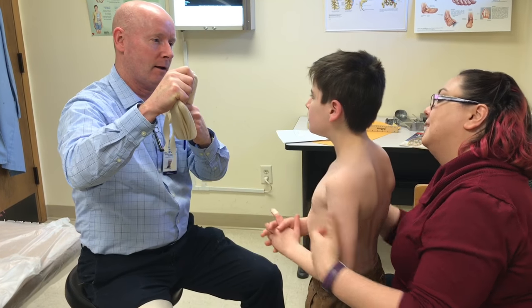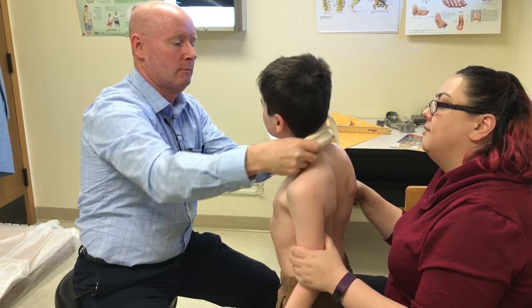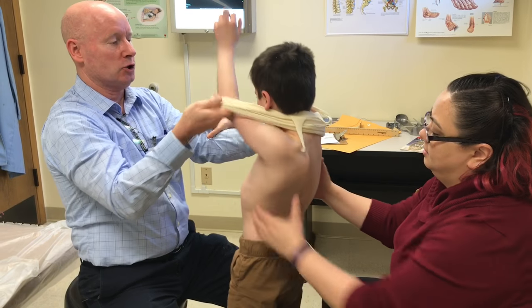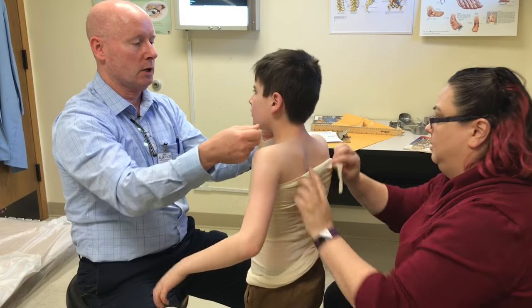Can I see? Just put it on, honey. How tight is it? There we go — see, it's not very tight. So now you can put your arm through the hole. Great job. And then that arm too — nice job. Now we're going to pull it down and tie off the shoulders so it's like a t-shirt.